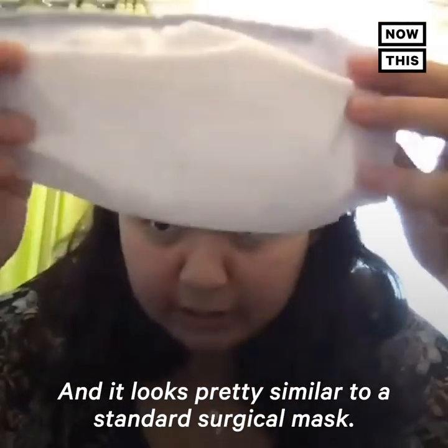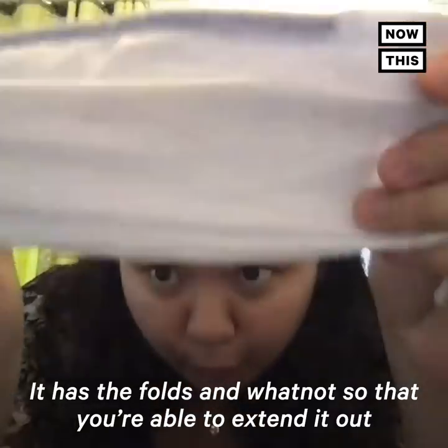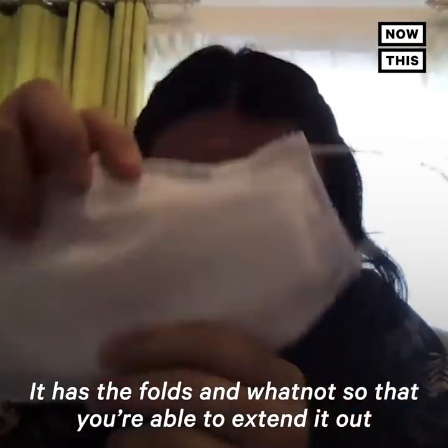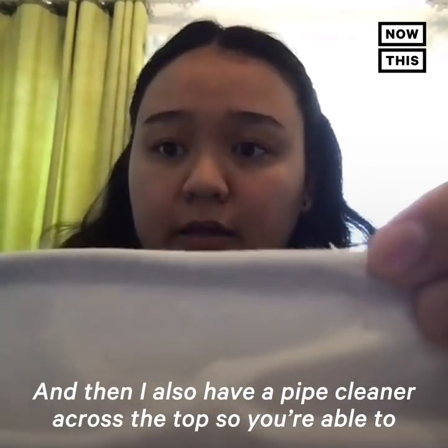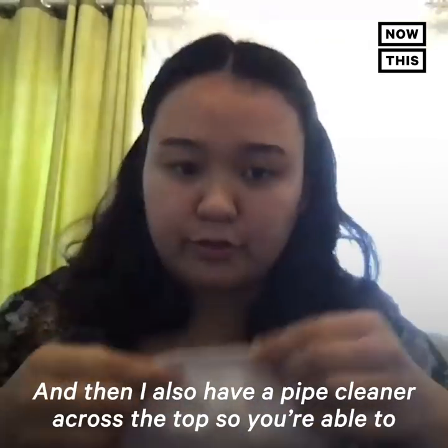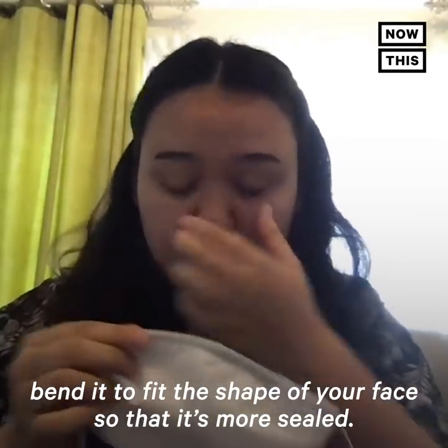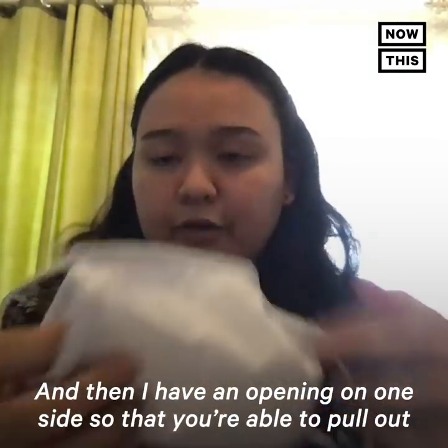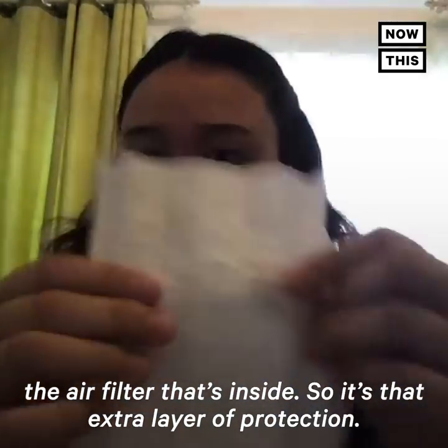Here's one of my masks — it looks pretty similar to a standard surgical mask. It has folds so that you're able to extend it out across your face. I also have a pipe cleaner across the top so you're able to bend it to fit the shape of your face, making it more sealed.